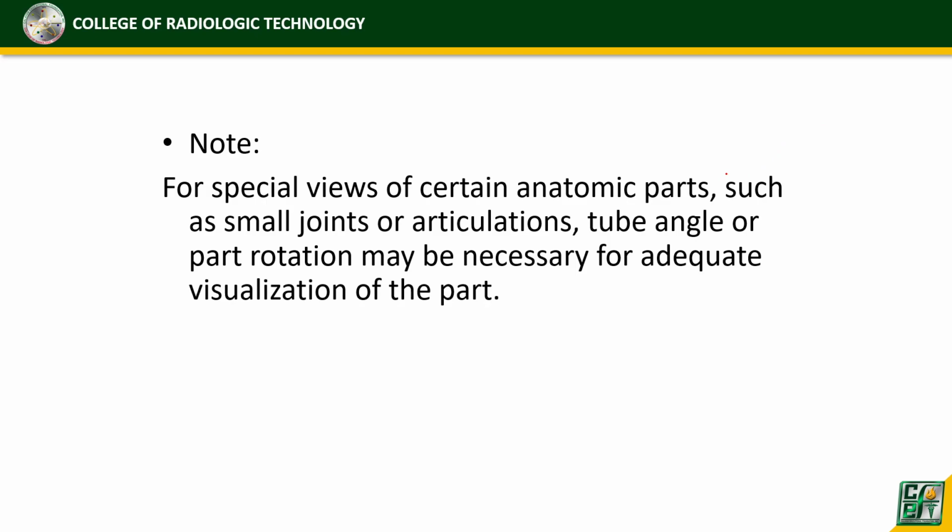Okay. Note, for special views of certain anatomic parts, such as small joints or articulations, tube angle or part rotation may be necessary for adequate visualization of the part. So sa madaling salita, hindi naman po lahat ng size or shape distortion ay masama. Kasi siya ay ginagamit din as technique to visualize, okay, certain joints and body part. Okay?